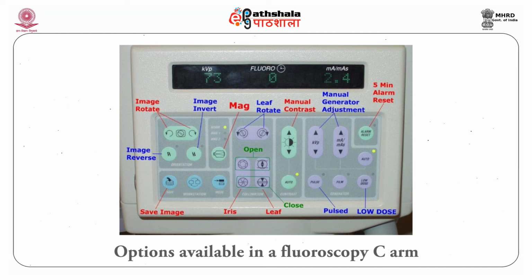In case of using a power injector or extension tubing, if hand injecting, be careful to synchronize the power injector while the images are taken. Move the personnel away from the table or behind protective shields during acquisition. Minimize overlap of field on subsequent acquisitions. Plan and communicate in advance the number and timing of acquisitions, contrast parameters, patient positioning, suspension of respiration with radiology and sedation team to minimize improper or unneeded runs.